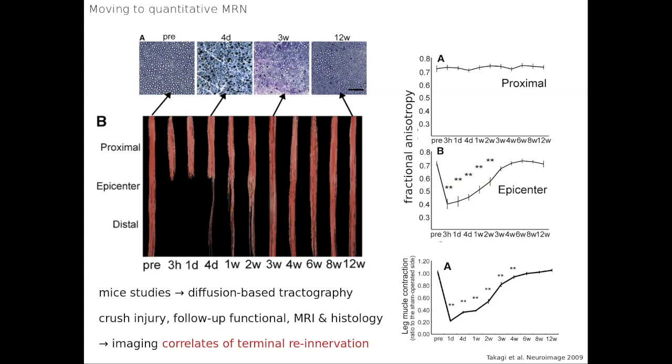During the regeneration, the anisotropy was increasing more and more, and this correlated quite well also with the function of the leg.